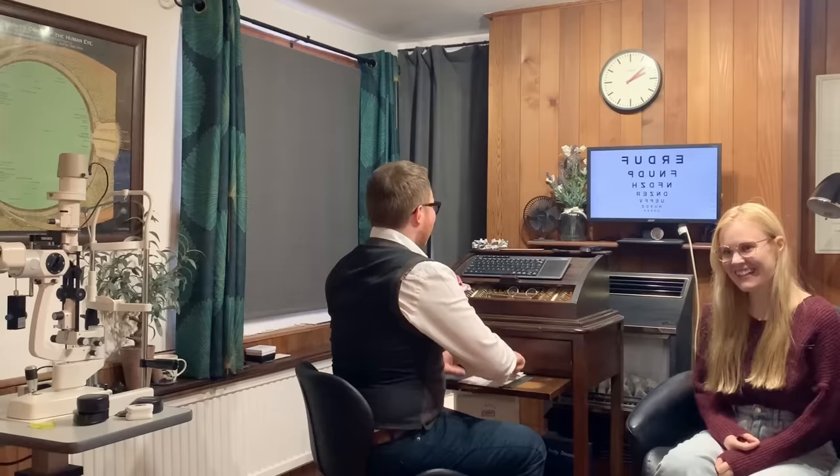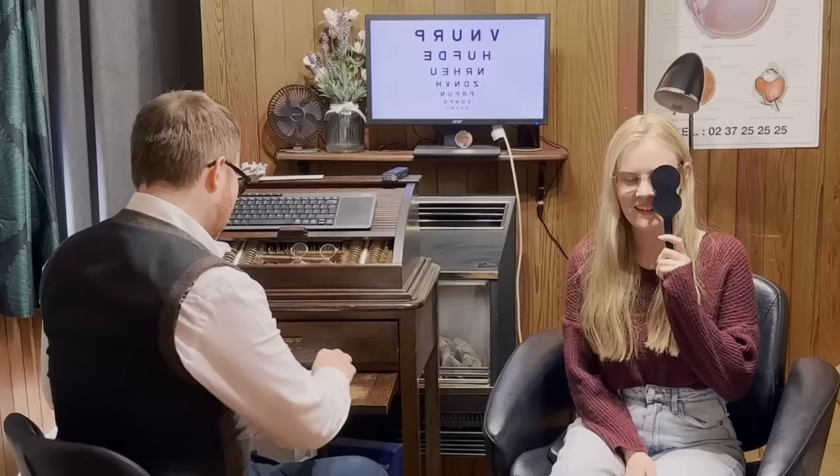Right. Well, what I'm going to do is just give you this cover to hold. I'm going to get you to pop it in front of your left eye for me. And I'll get you to have a look at the letters again. I'll just jumble them up to make it a bit more exciting. And what's the smallest? Now, don't worry if it's not the very bottom one. Yeah, I think I'm more comfortable with the one above the bottom. Okay, yep.